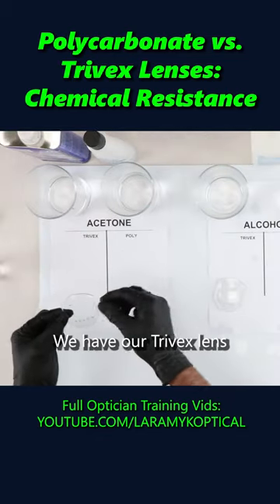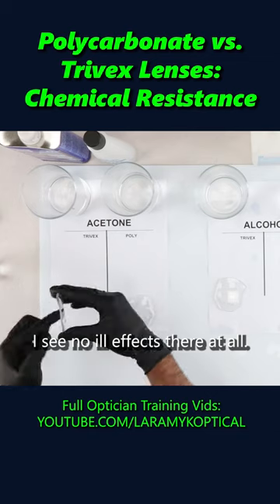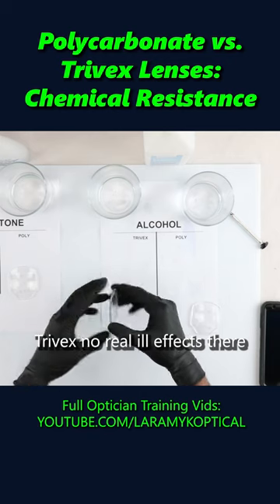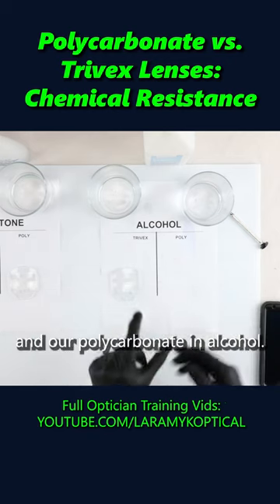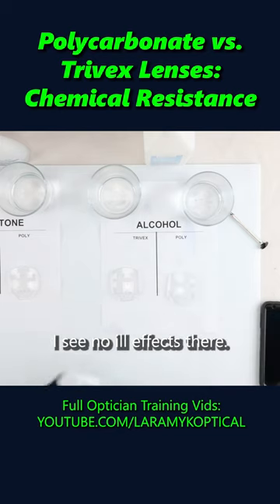We have our Trivex lens that was in acetone for 10 minutes — I see no ill effects there at all. Trivex in alcohol — no real ill effects there either. And our polycarbonate in alcohol — I see no ill effects there.